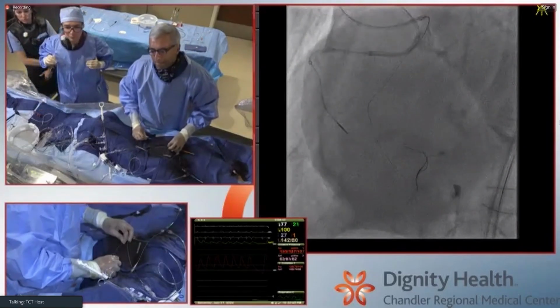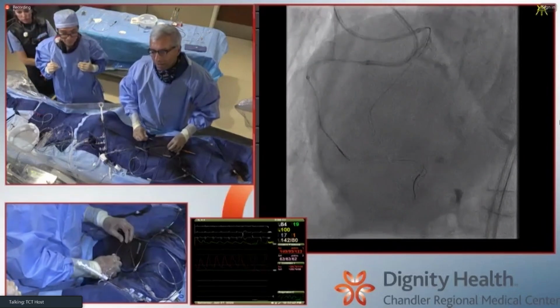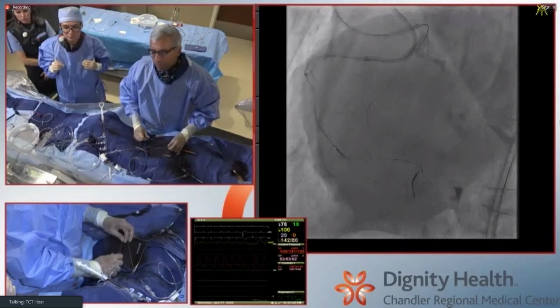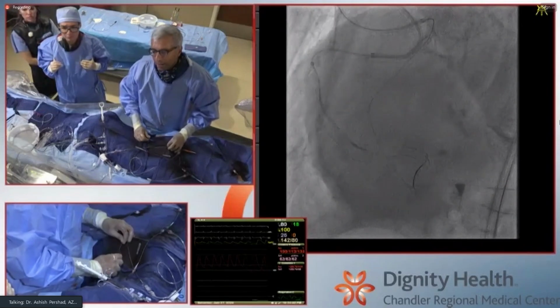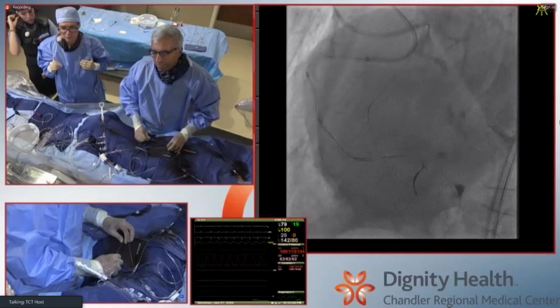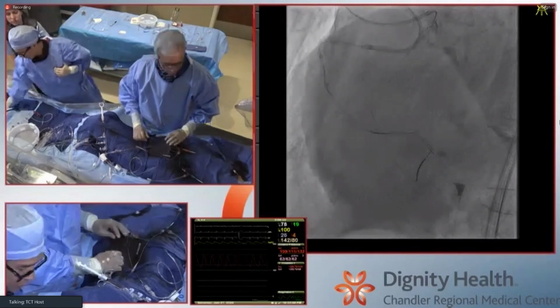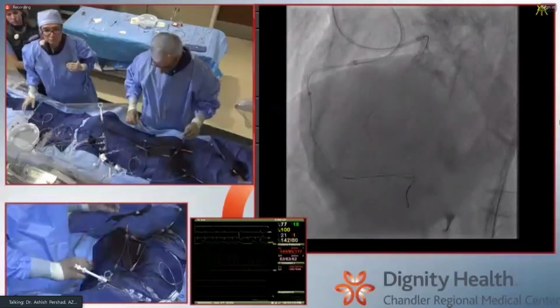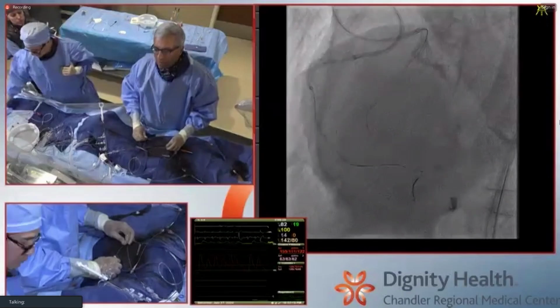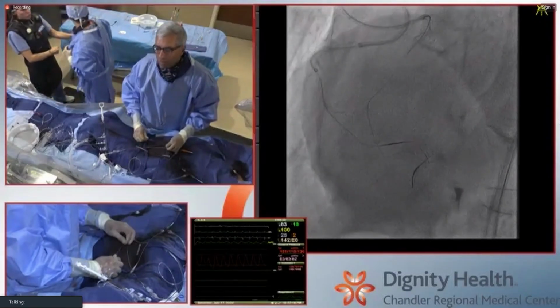You're tracking right along the vessel, and you're also not bending as you go, right? You're not spinning the Pilot 200. Nope. You're not drilling. It's just kind of proceeding. This is the Mongo. A Mongo has a core stopping back of the tip. That Mongo, if you're subintimal, will knuckle on you fairly quickly. Yeah, okay. Nice.